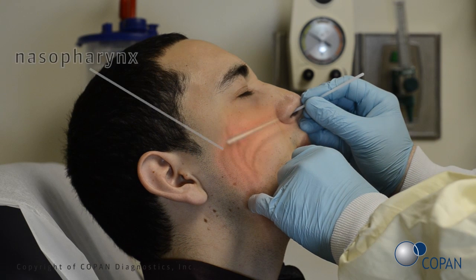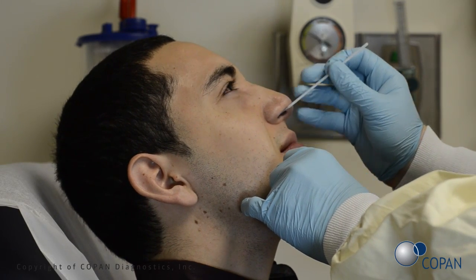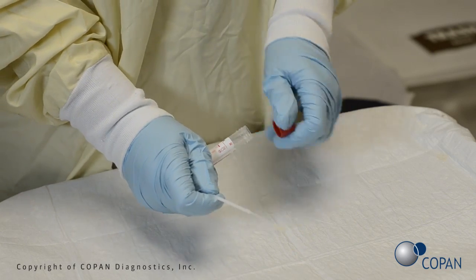As a visual reference, the swab should be inserted about half the distance from the opening of the patient's nostril and the ear. Rotate the swab several times. Gently remove the swab and perform the test according to the manufacturer's instructions.